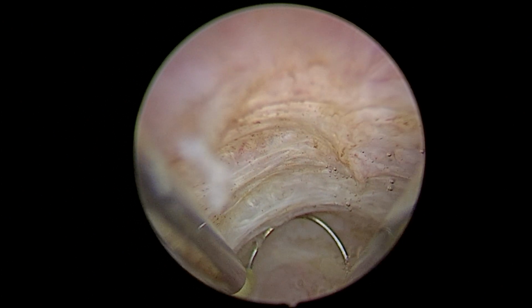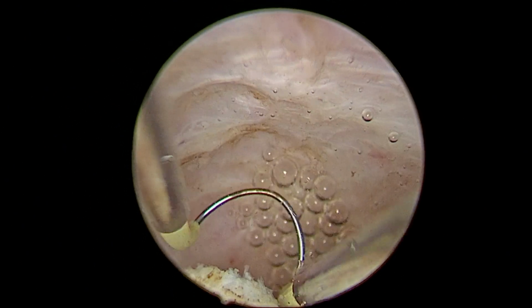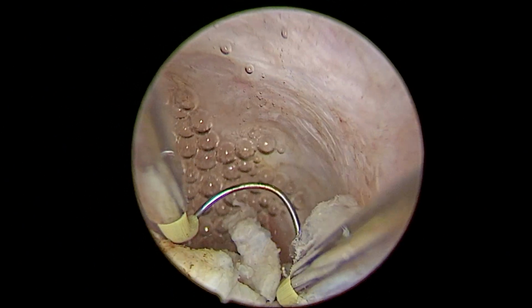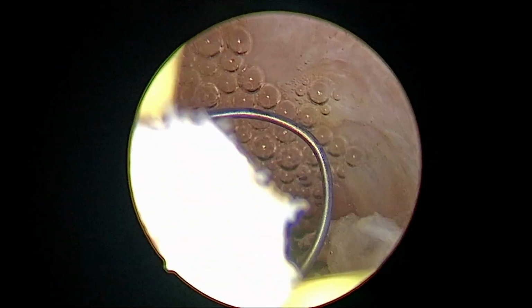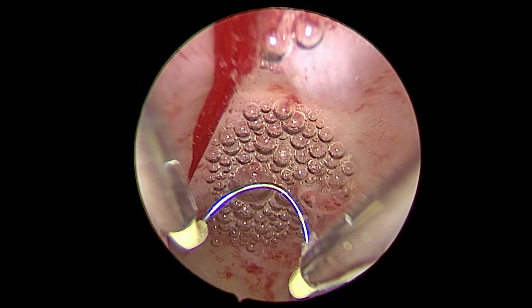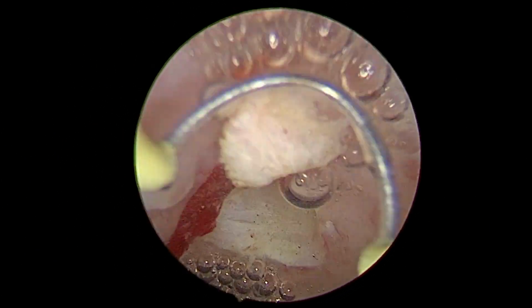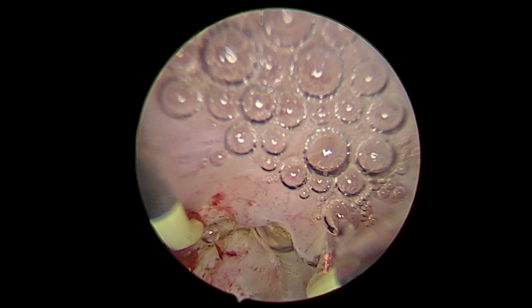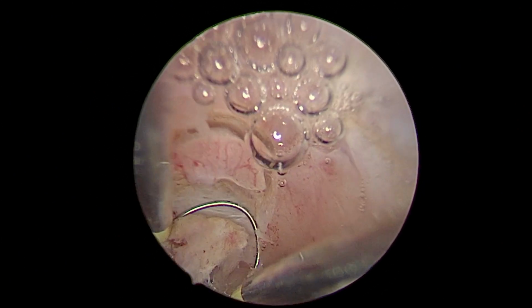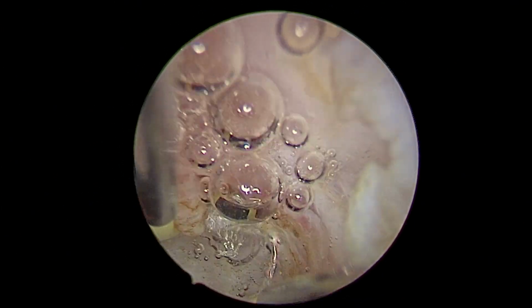Now here you can see this is the caudal end of the isthmocele towards the external os, which is resected to attain a nice slope. Then we go up towards the cranial end of the isthmocele, and here again, if at all we find that the angle between the isthmocele and the upper uterine cavity is also more angulated, then we can resect it and make it soft.